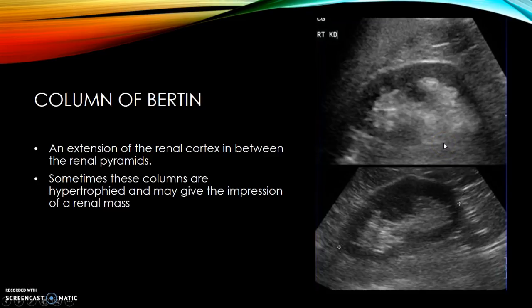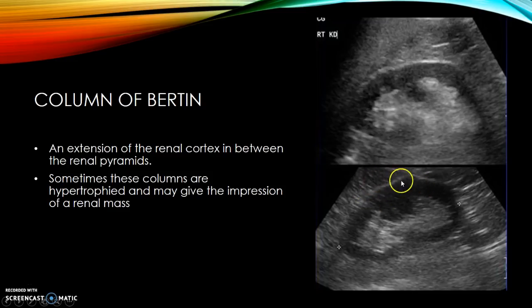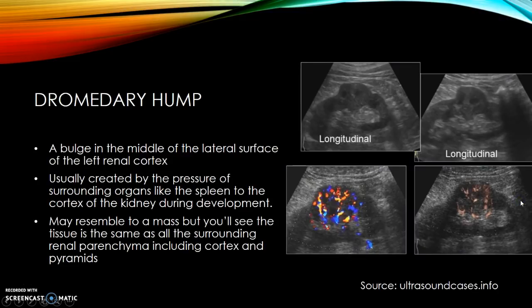The columns of Bertin are cortical bands between the medullary pyramids. Sometimes you have a large column of Bertin, called a hypertrophied column of Bertin, which can be mistaken for a mass. These patients have a lot of sinus fat with a little invagination — that's just a larger-than-usual column of Bertin. You can see it has the same echogenicity as the rest of the renal tissue and there is no contour defect, making a tumor highly unlikely.